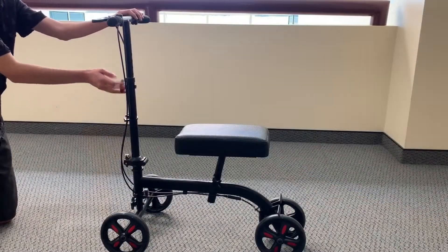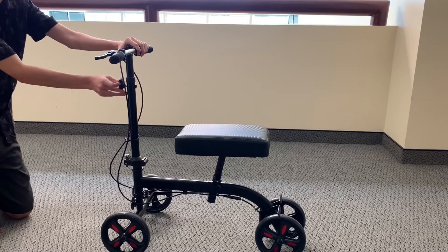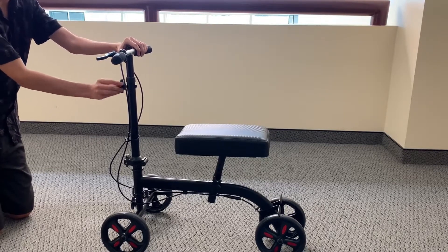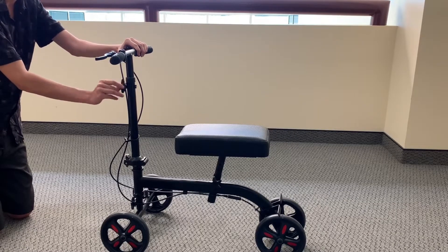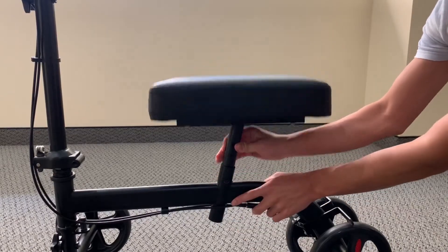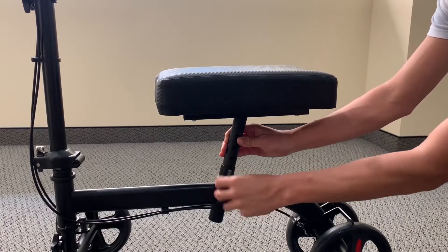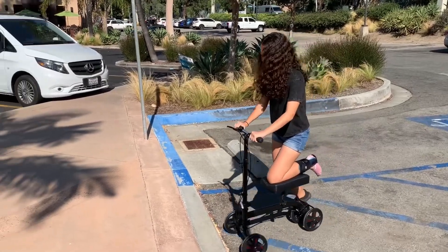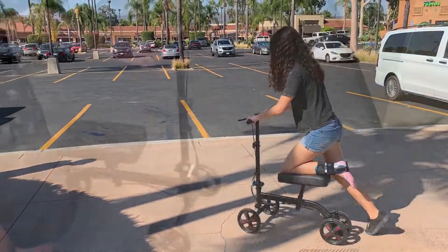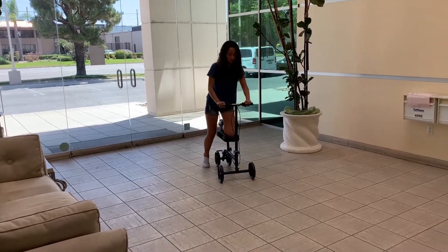It includes an adjustable knee and handle height that accompanies patients of all sizes. The steerable front wheels allow for maximum maneuverability at 270 degrees.